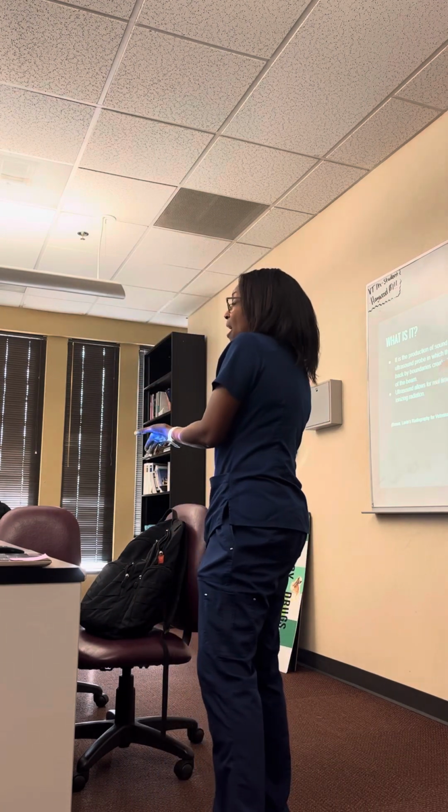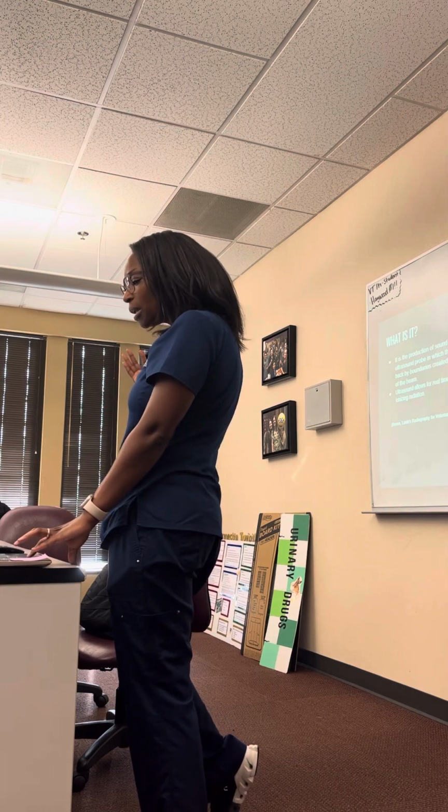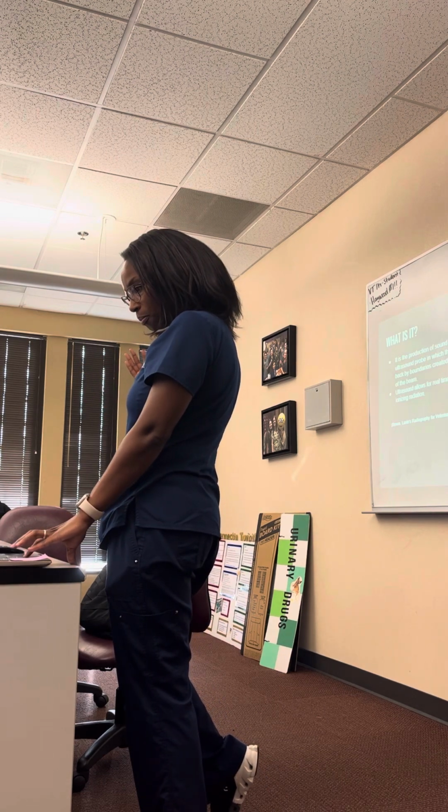a screen, right? And then how we look at the image is we call it echogenicity, right?